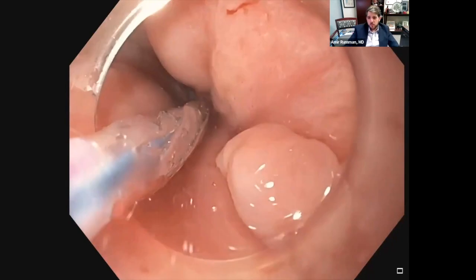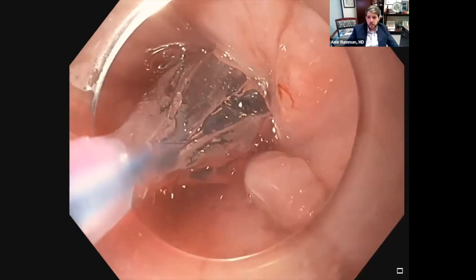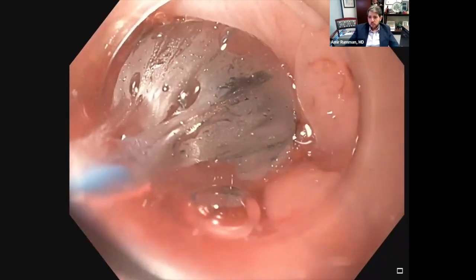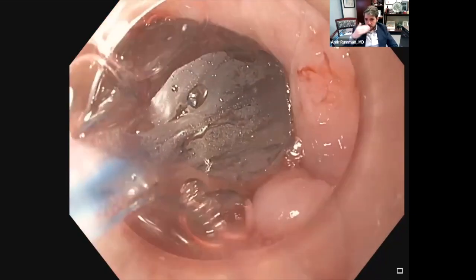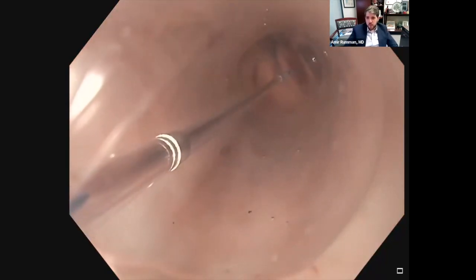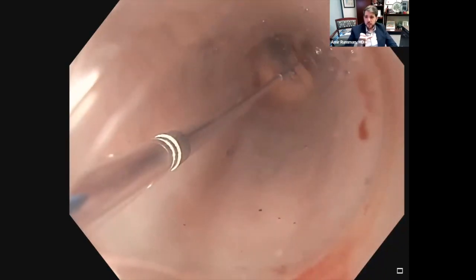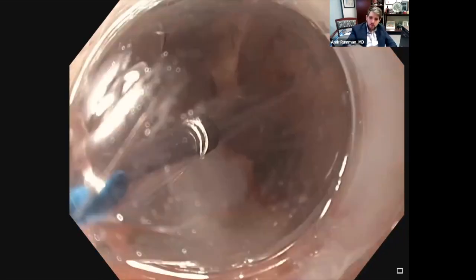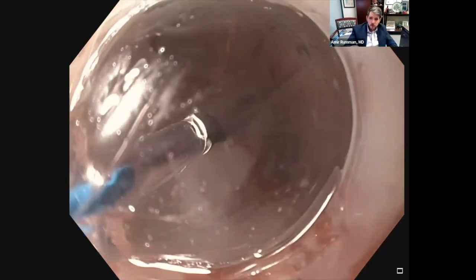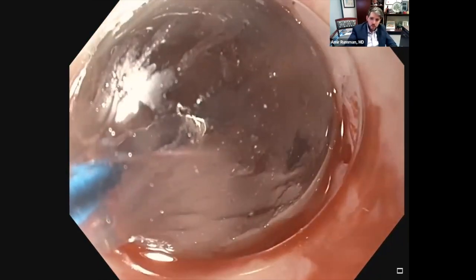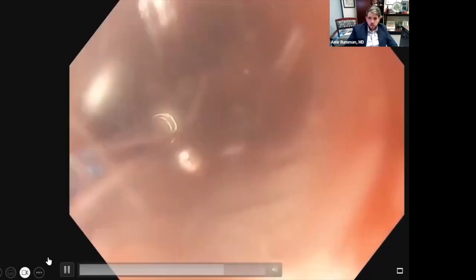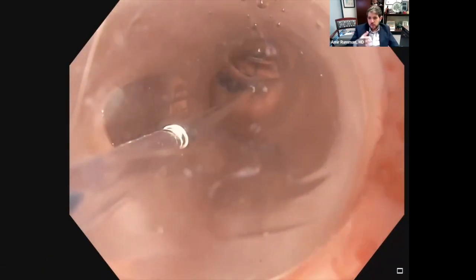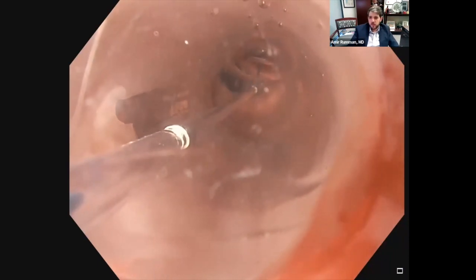Here we're passing through the scope a controlled radial expansion balloon dilator and we're slowly inflating it, trying to get it positioned across the center of the stricture. We're using the looking-across-the-balloon technique as we're slowly inflating and watching for the tear to happen. You can see the wall is blanching — it's very fibrotic — and very slowly we're starting to see our tear forming here.